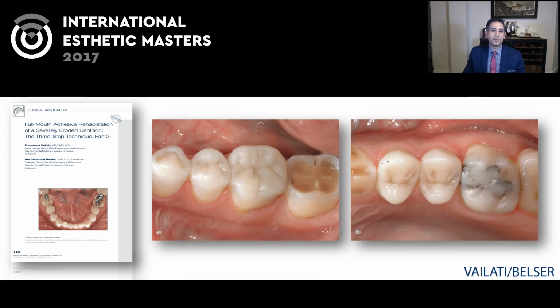Now, the terminal molar is not treated, first of all, which we mentioned. And the other thing is that if you have existing restorations, you have the choice of taking out the restoration and then doing this, or during this step, you can just place it right over. Of course, when you go to the definitive stages, you'll be replacing any alloys or any previous restorations. But for now, since you're just testing the vertical, you can actually do these on top of other restorations without replacing them.